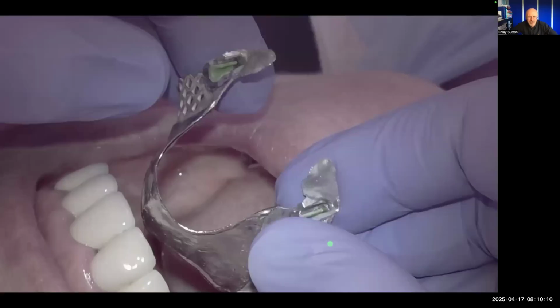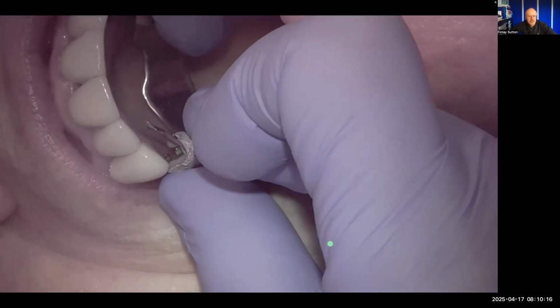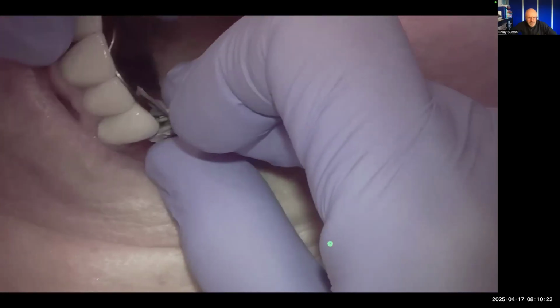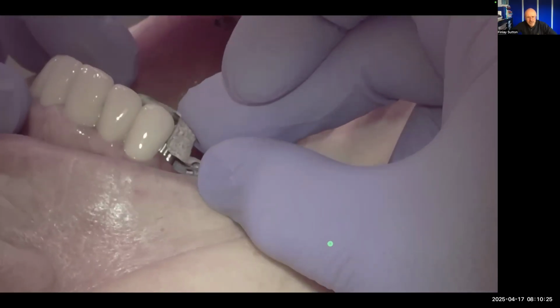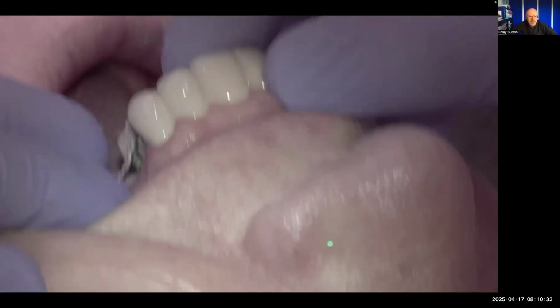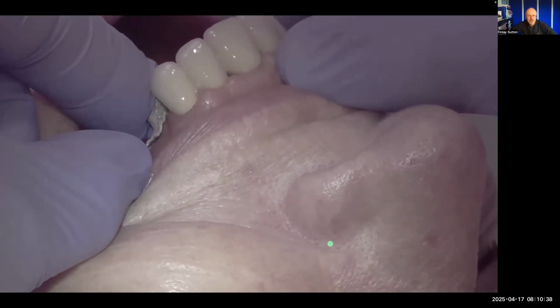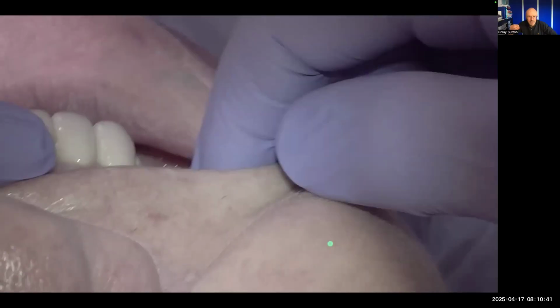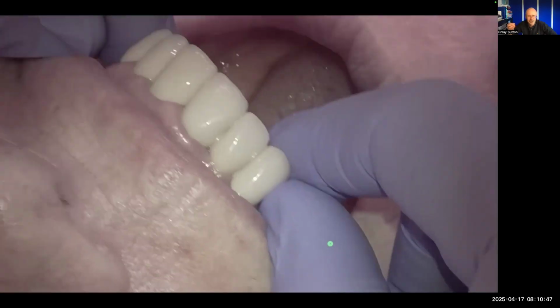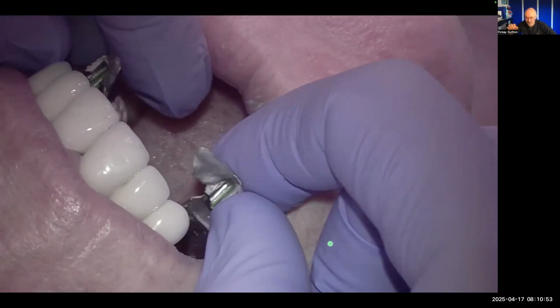So this was the first thing that I did. Just tried that in the mouth and just gently seated it over those areas. When I'm trying in these metal things here, I'm always quite careful that I don't press too hard because I don't want it to wedge itself in, number one. And secondly, I don't want to hurt the patient either because sometimes some of the metal can just dig in and it can be really painful. And if it's wedged in and it's really painful, it's a problem. But that fitted just beautifully, which is great. It just sat down really lovely. And then I could just get my fingernail underneath the edge and pop that out.